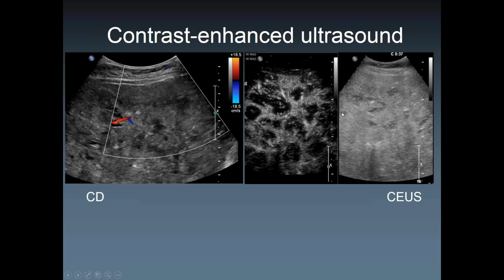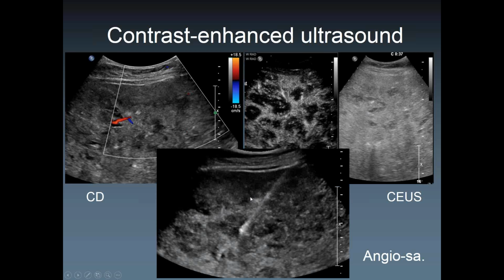Based on that fact, it's a side-by-side view, as we call it. So it's an unenhanced B-mode image in real time. After a minute of contrast, you see the parenchymal phase, and these are the enhancing portions. You're going to get to those. You can either do it in real time, or you identify the portion and then go through that, and it ended up being angiosarcoma, and the patient didn't live longer than a month after this biopsy.